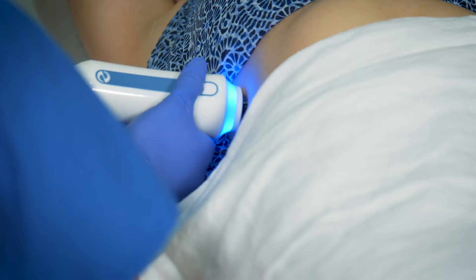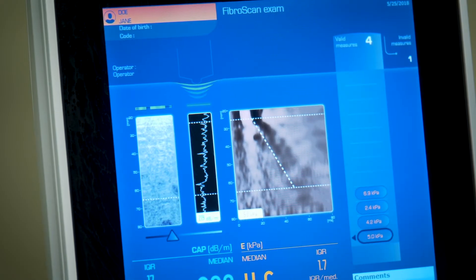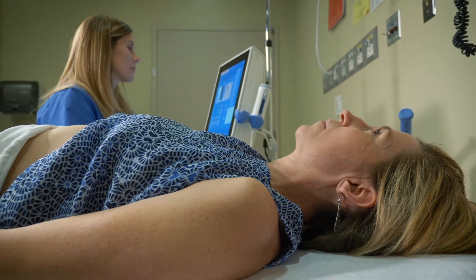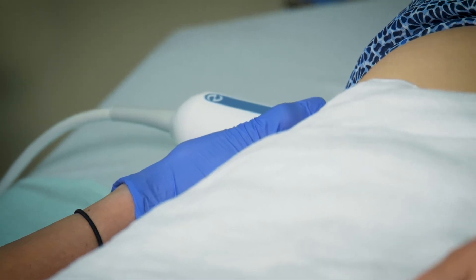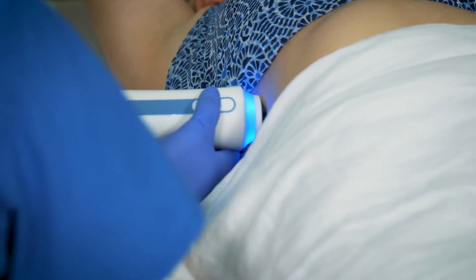Fibroscan is like an ultrasound. It doesn't take more than five to ten minutes in most cases, and it's very simple. You don't need any preparation other than fasting for three hours. On the right side, we have to expose the liver area, and the technician will find the right spot where they can put the probe.